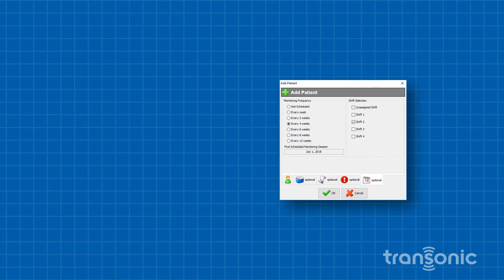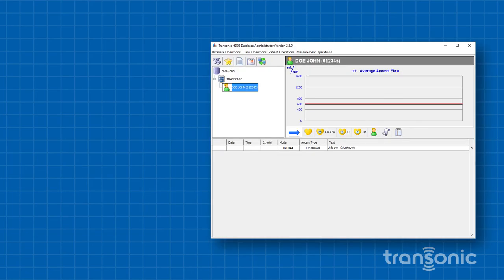Click OK to save the scheduling settings. You have now scheduled a patient.